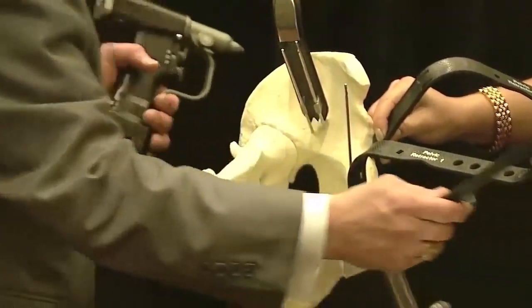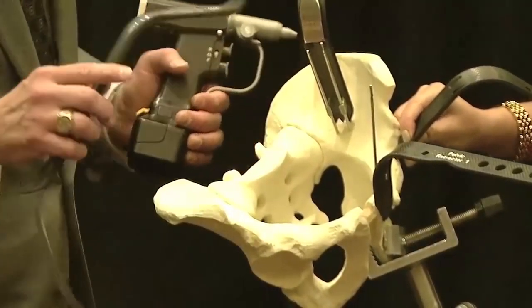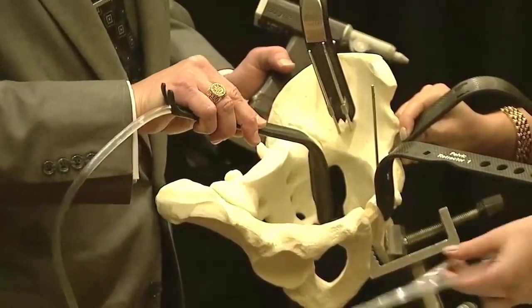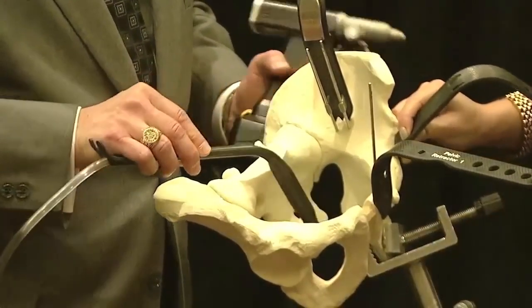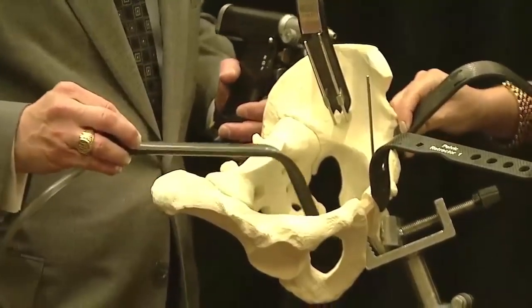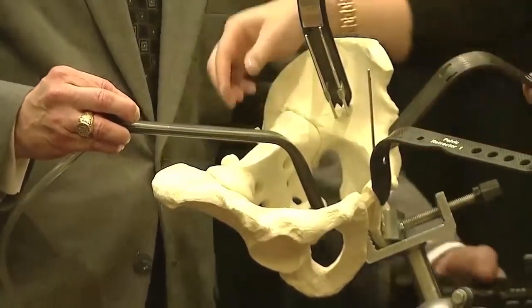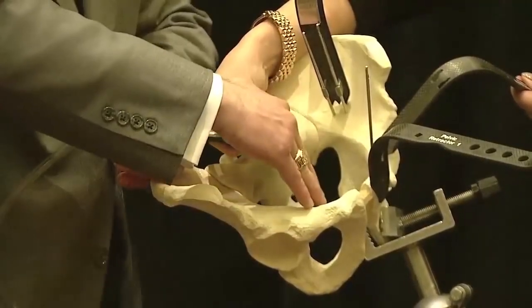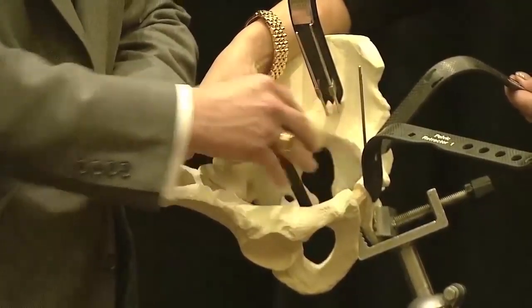And then this next retractor, which we're very excited about, is the suction retractor. This fits down in the lesser sciatic notch, right along the spine, and it's got suction tubing on it, so it drains by gravity the bottom of the pelvis. The blood that accumulates in the bottom of the pelvis is drained out. And this pulls the bladder and the pelvic contents out of the way so we can see this whole field.